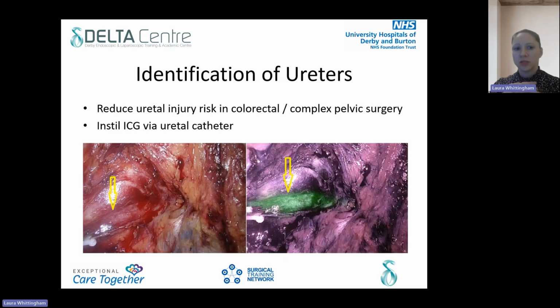It can also be used to clearly identify the ureters. So ICG would be instilled into the ureters by a catheter, and this is particularly helpful in colorectal surgery or complex pelvic surgery to reduce the risk of injury to the ureters.